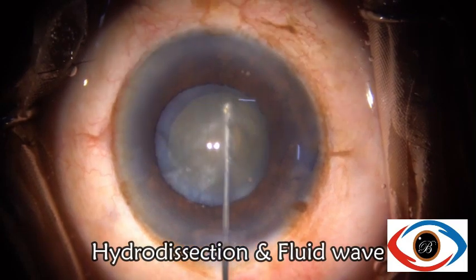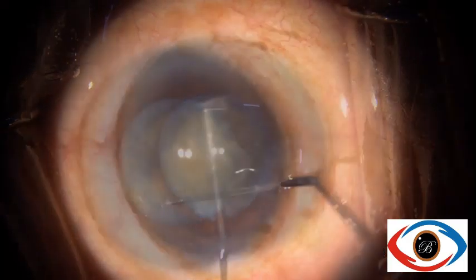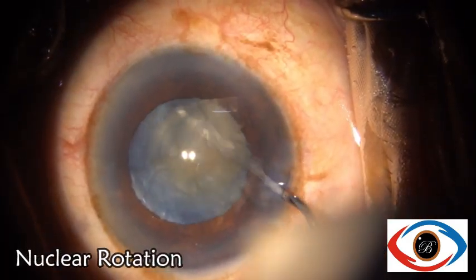When hydrodissection is done, even in this case of mature cataract, we can appreciate the fluid wave.